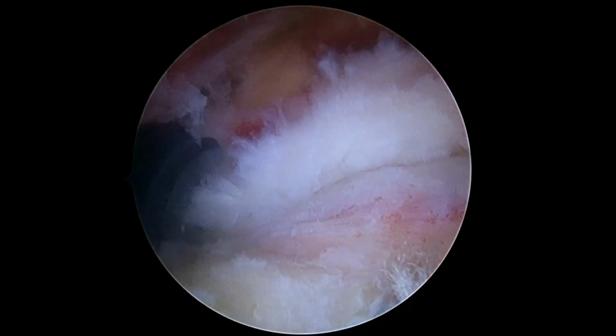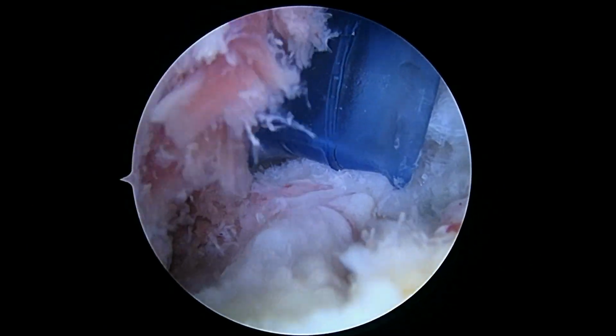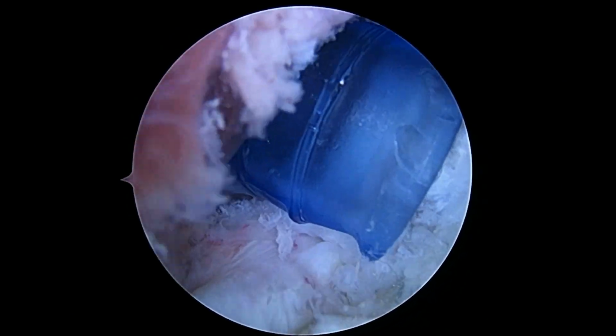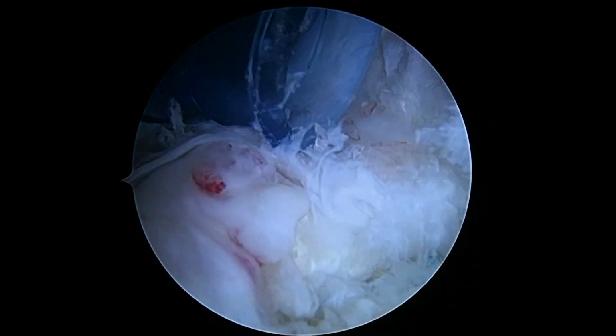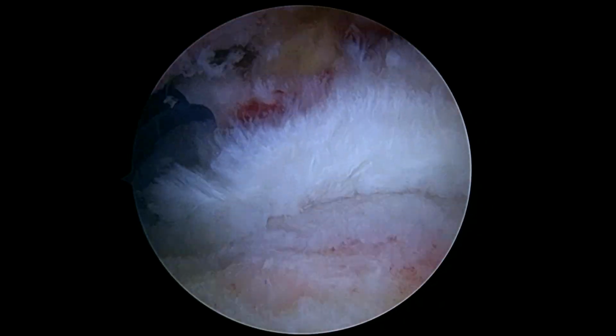Okay, so here's the tear. We've already tenodesed the biceps in the front. That's it way up here. Maybe if I rotate the arm, you'll see it. But there's some sutures down right there. That's holding down the biceps. That's actually the biceps right in the middle of the screen. It's in the groove, but it's tied back down.